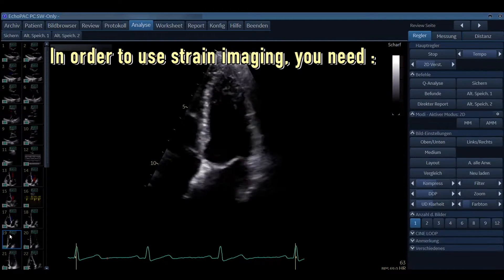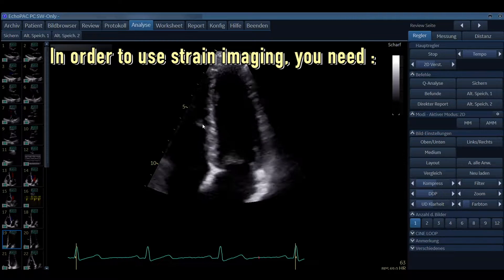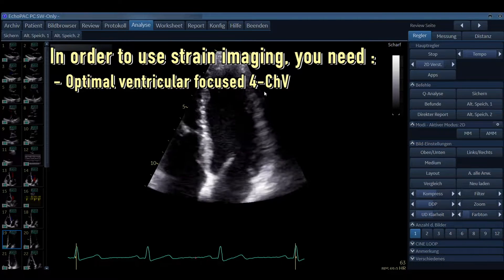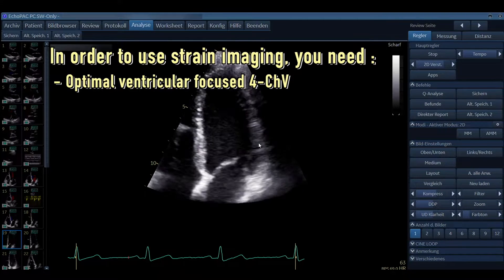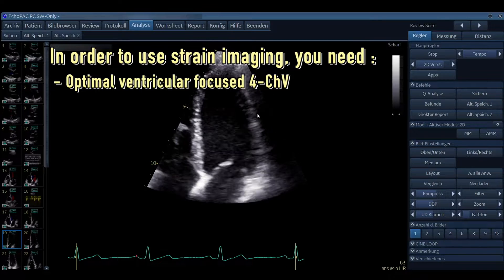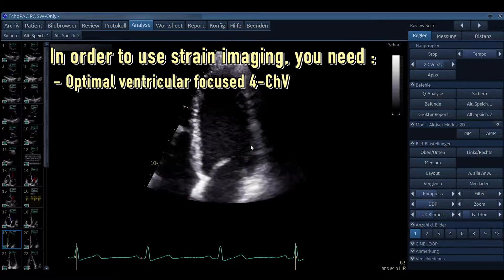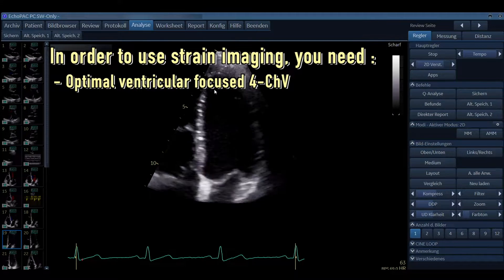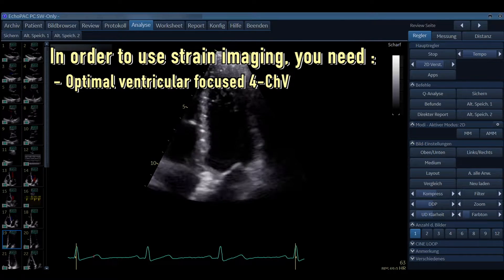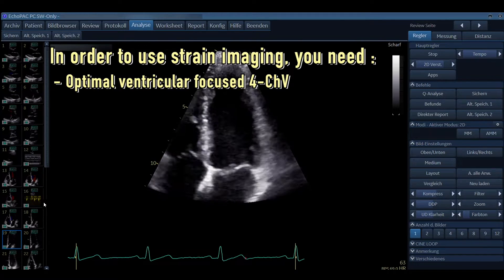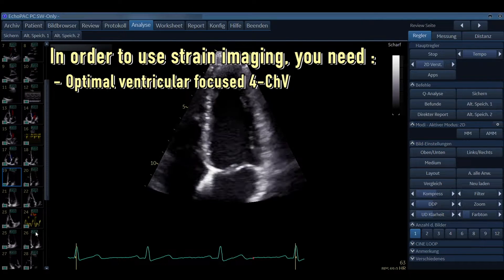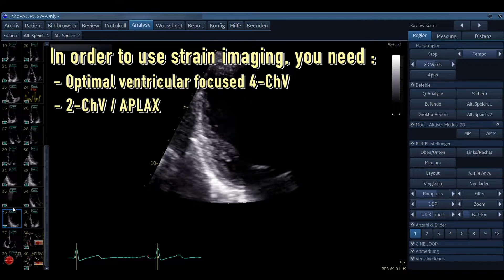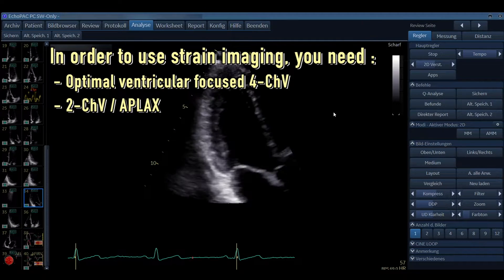If you want to use strain imaging, you should have an optimal ventricular-focused four chamber view. When optimizing the image, you can always use more gain so that you can delineate the myocardium or endocardium even better. Take a look at how thick the myocardium is — you want to always adjust the region of interest to the myocardium. Then the next views you will need are not only the four chamber view, but also the two chamber view and an apical long axis.